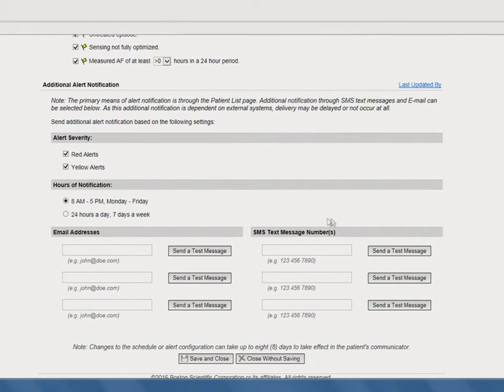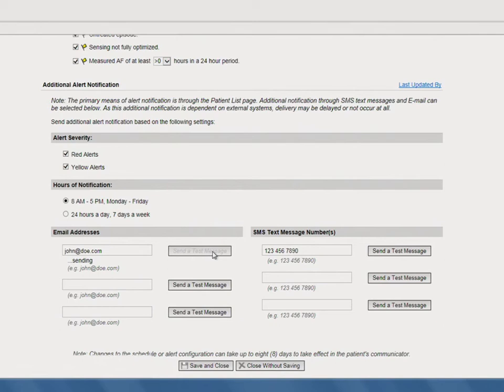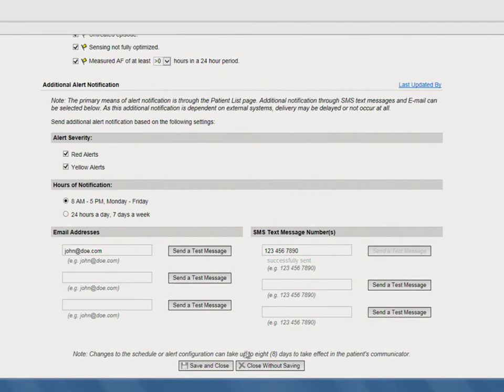Simply enter the information in the available fields, making sure you match the format shown in the examples on the page. We strongly encourage you to send a test message to each email address and phone number you're including for these additional alert notifications. Once you've sent your test message and are confident the information entered is accurate, click Save and Close. Please note that these additional notifications are optional and delivery is not guaranteed.